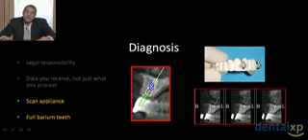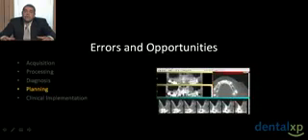We need to also make sure that we make the most diagnostic images possible, which means scanning patients with scan appliances, with full barium teeth. We get the best three-dimensional reconstructions that way, and again, we get the most diagnostic images.